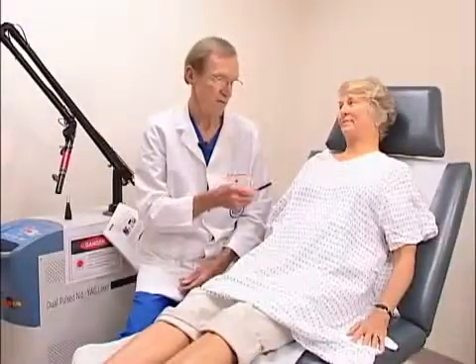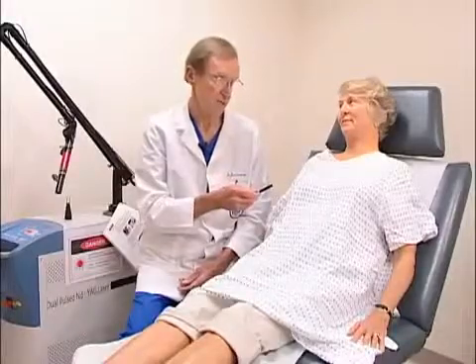This is Blair. She's a 70-year-old woman who had a facelift 5 months ago. The eco2 laser for Blair offers us the opportunity to go into the deep dermis and remodel her collagen while changing the skin pigmentation and the texture of the skin. It will improve the quality of her skin, and it will make a real change in the aging of her skin.